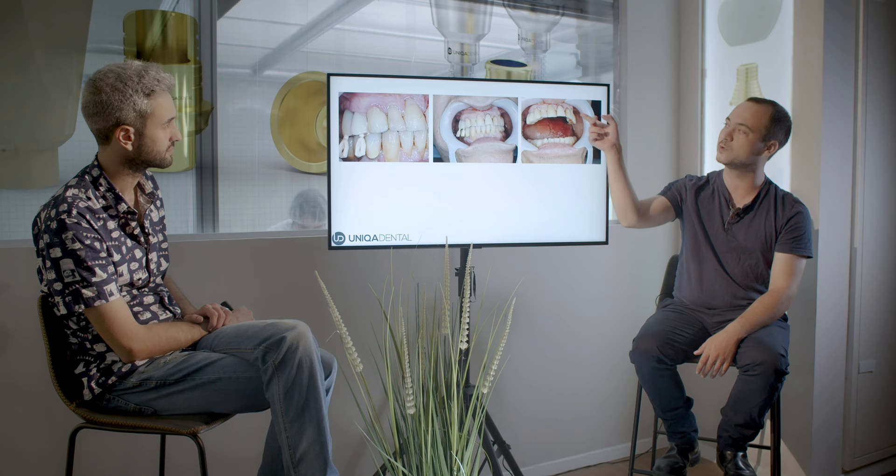And because you already have those implants and they're quite near the tooth you want to restore, you can use them for temporary restoration — and we're sure it will hold. When we take off these crowns to restore the missing tooth later, we just return the old crowns. Here you can see it as a temporary restoration. We have those two crowns we restored upon and we close the holder from PMMA — no problem. We made an exact copy of tooth 11, but took a little off the occlusion because you don't want interfering movements that could cause it to break or shift.